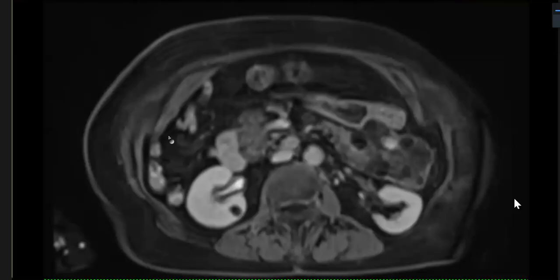Sir, they occur in elderly females, and there is very little malignant potential. What's the age group? Older age group. What do you mean older? What is the average age of presentation? Sir, in the 60s to 70s, this is a grandmother lesion, called serous adenoma. So you were saying that there is some possibility of malignant transformation. So this is rare. Mostly these are benign.